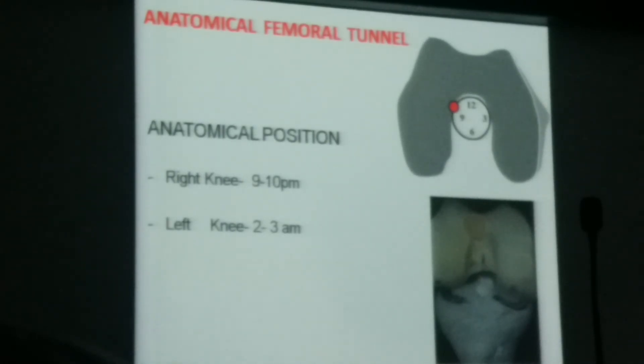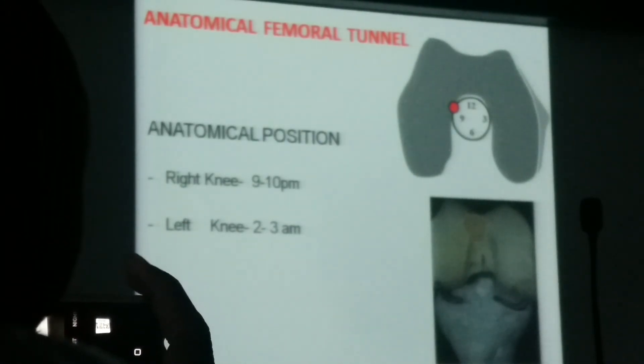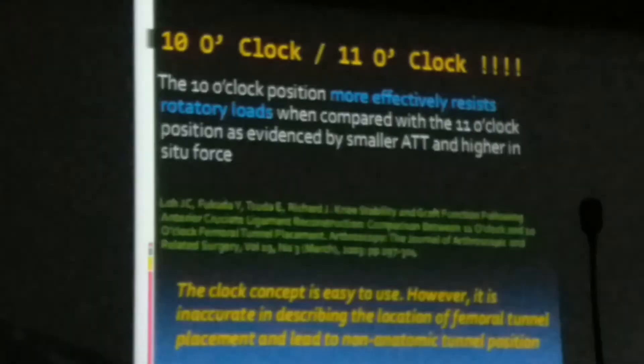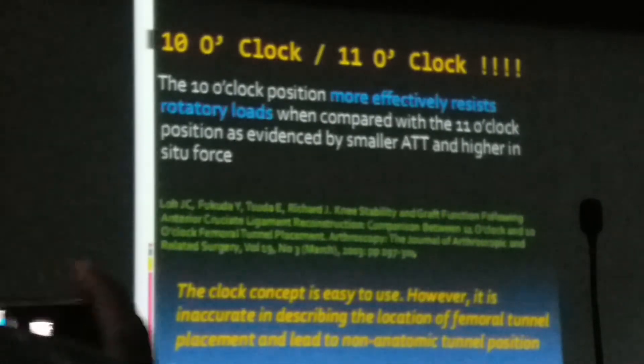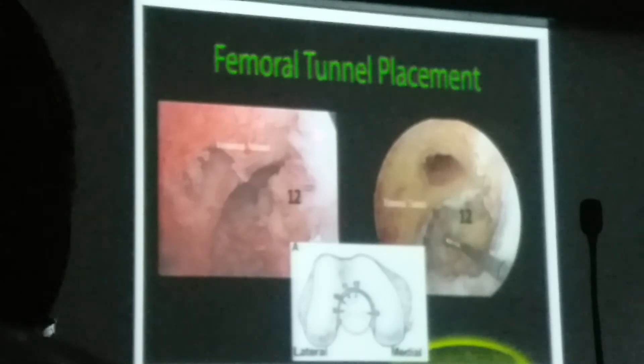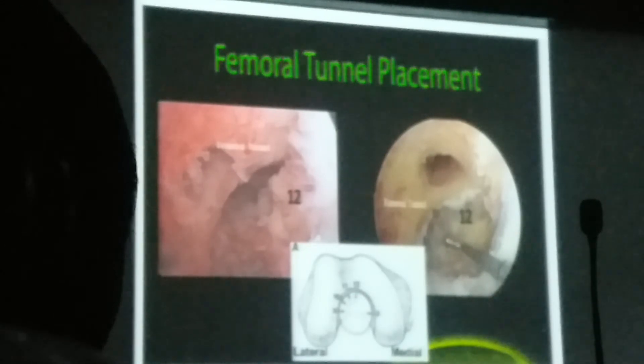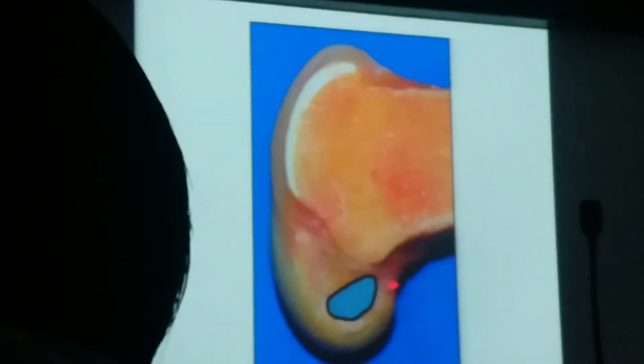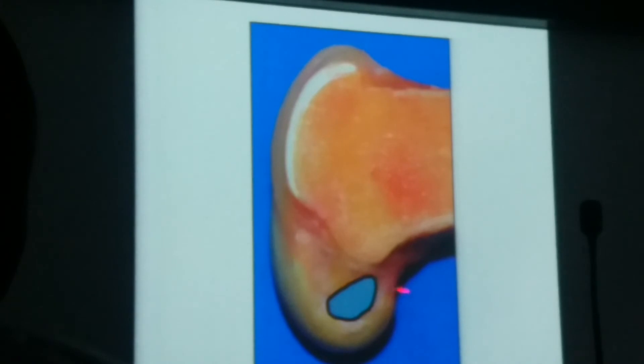Using the clock concept: for the right knee, choose the 9 to 10 o'clock position; for the left knee, choose the 2 to 3 o'clock position. The 10 o'clock position more effectively resists rotational load compared to the 11 o'clock position. Your tunnel should go posteriorly and deep, midway to the actual attachment site. A vertical tunnel means high chance of impingement.